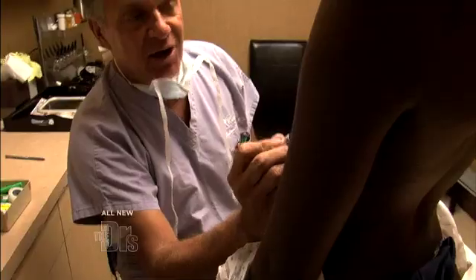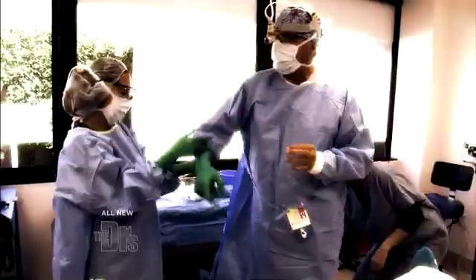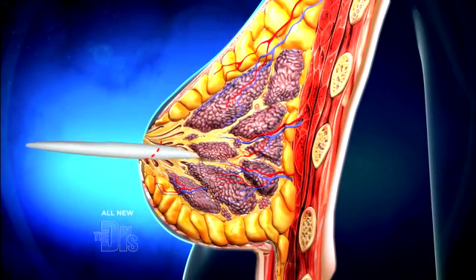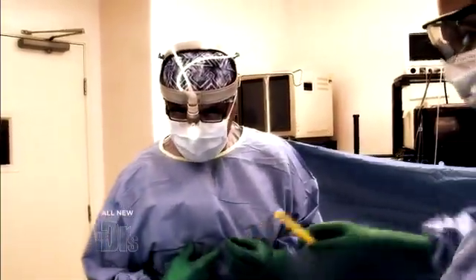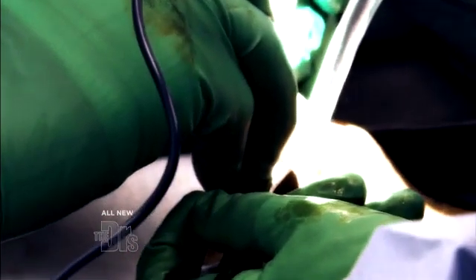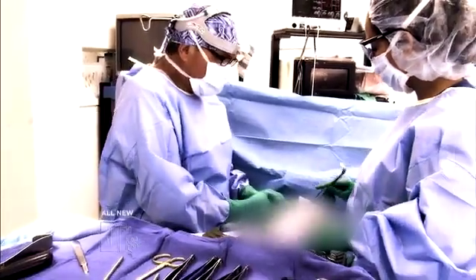You're an A cup starting off — we want to take you to a nice medium C cup. This procedure is all about creating the pocket just right, so there's a little bit of give around that implant so that it can move naturally in the body. We're going straight down into breast tissue, looking for that pectoralis major muscle, which will be my next landmark. You'll see very little cutting — I'm going to do a lot of this with my finger.